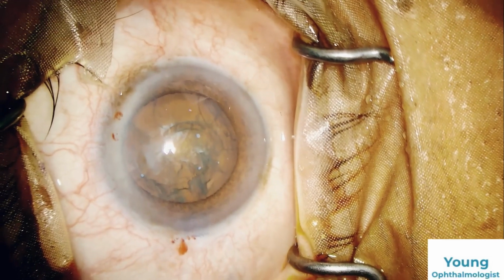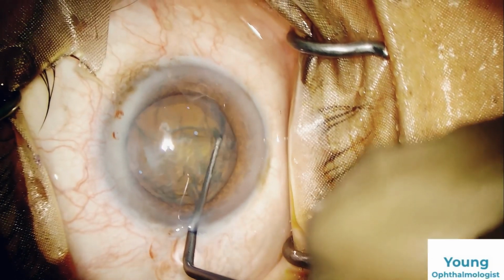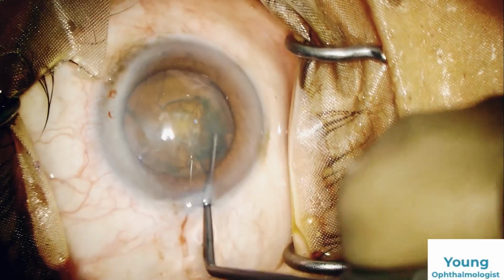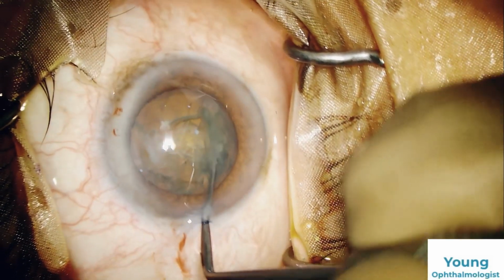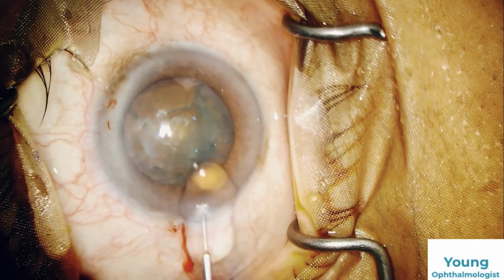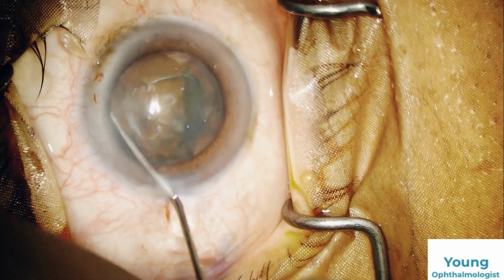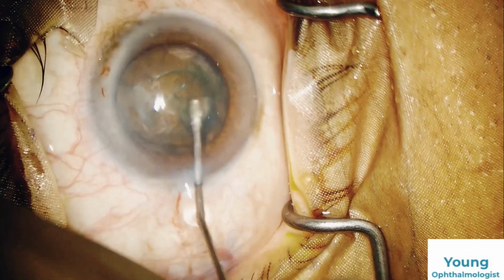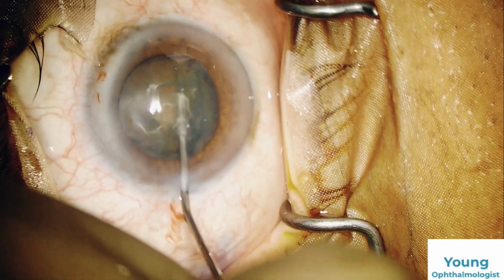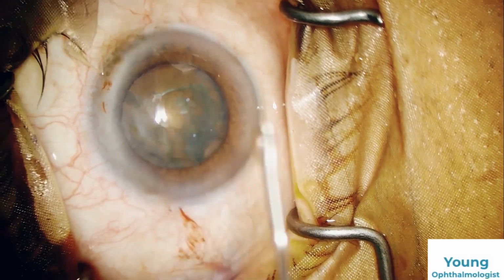Now I will use a dialer to rotate the nucleus. Check the hydrodissection status. As you can see, I'm able to rotate the nucleus, but it's a little bit stuck. So we'll again do some hydrodissection. Nucleus should be easily rotatable. Otherwise, during phaco, it will put stress on the zonules. So you should not hesitate to repeat the hydrodissection.